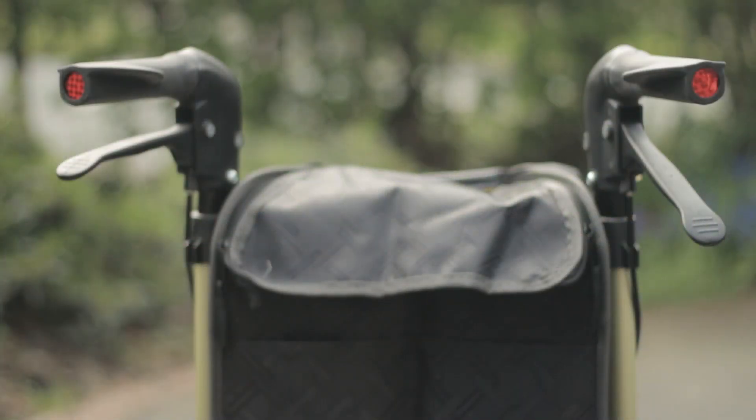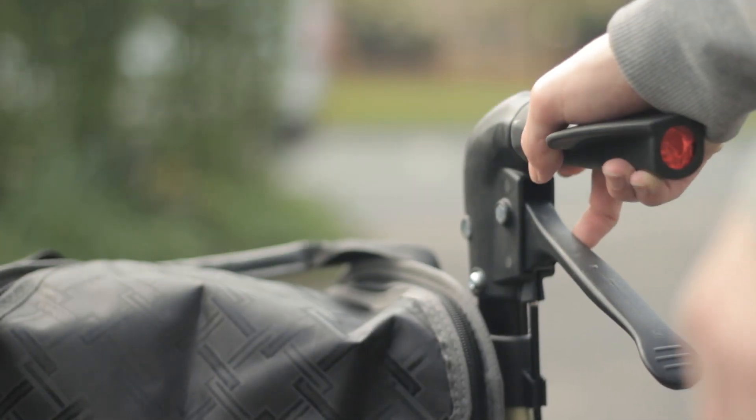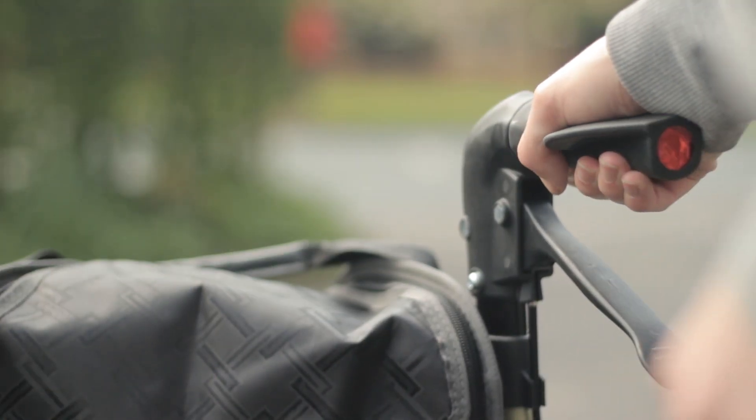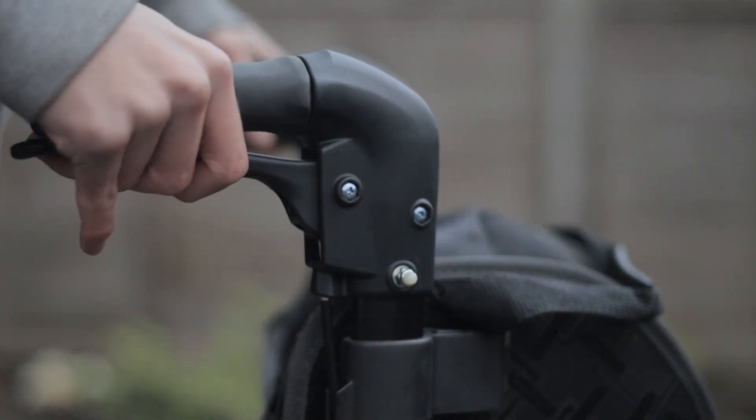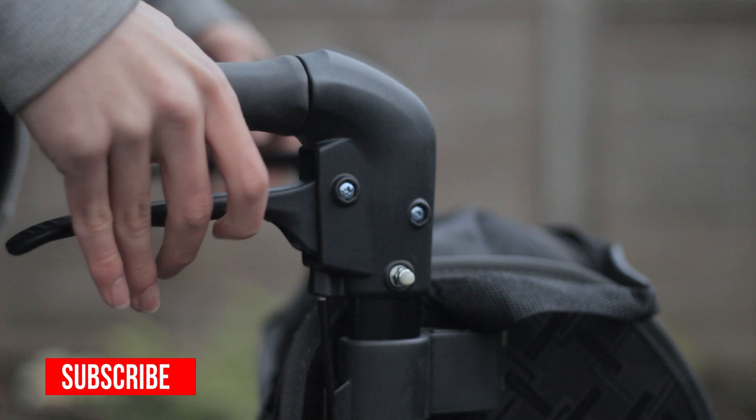The handles have two reflectors on the back as well as being ergonomically designed, giving a comfortable grip. The brakes on the rollator are effective and easy to apply by simply pushing them towards you.